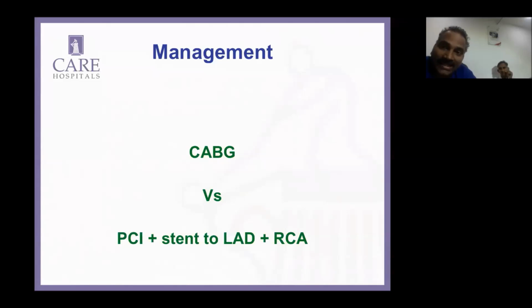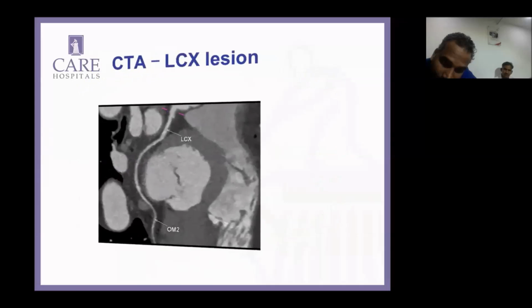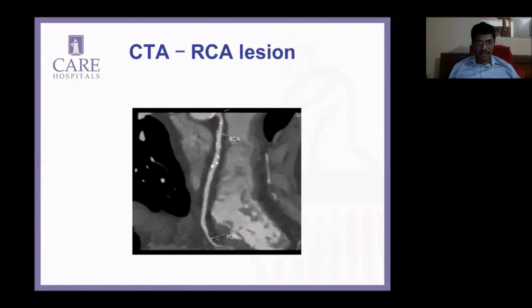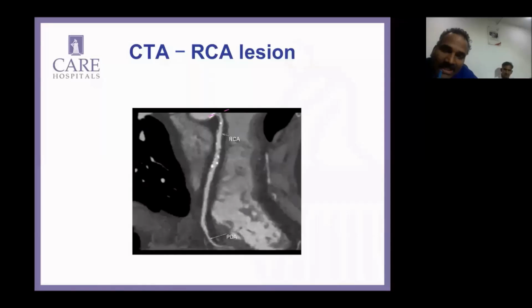And another thing, the tight stenosis which you are able to see in CT, in RCA, I just want to know from you, is this RCA a normally located RCA, or is it coming from the anterior part of the sinus? It is more anterior, Sharath, actually. Yes, from the same sinus, definitely, but from the anterior aspect of the sinus. Another thing which I observed in many cases: wherever your RCA is anterior in origin, we tend to miss the ostium, and we misinterpret ostial lesions.